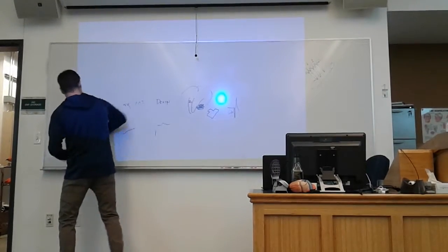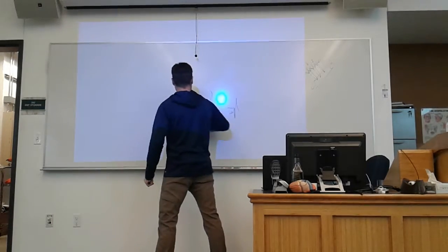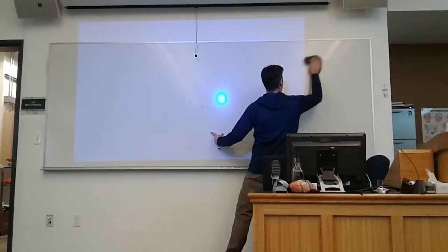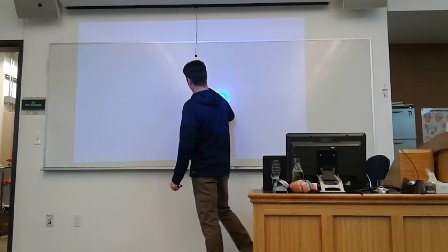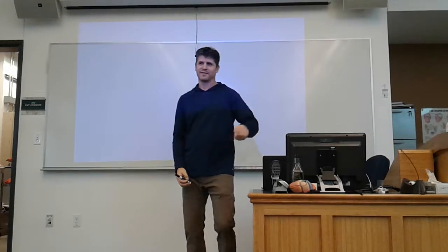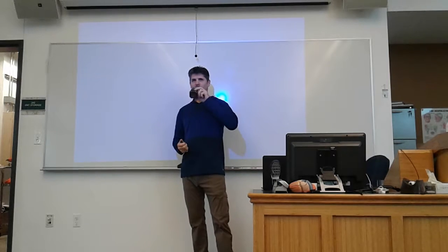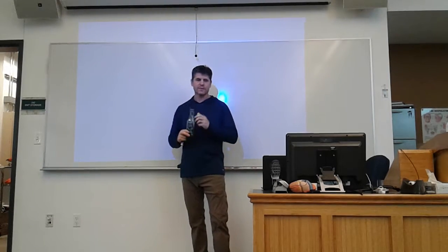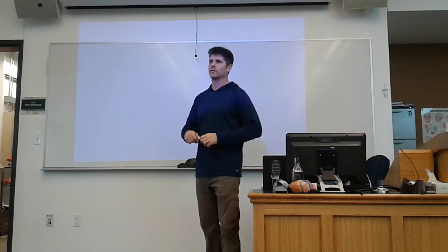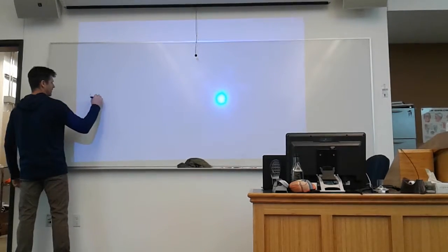Okay, so if I see someone with ST depression, that's not indicatively bad, that could just be normal for them? Oh, Jesus. Why would that not be bad? Is it good for your heart to be ischemic? No, it's really not. So if there's ST depression, they need to go to the hospital. If they have ST depression, you'll most likely be traveling down a chest pain protocol of some sort and transporting them someplace.